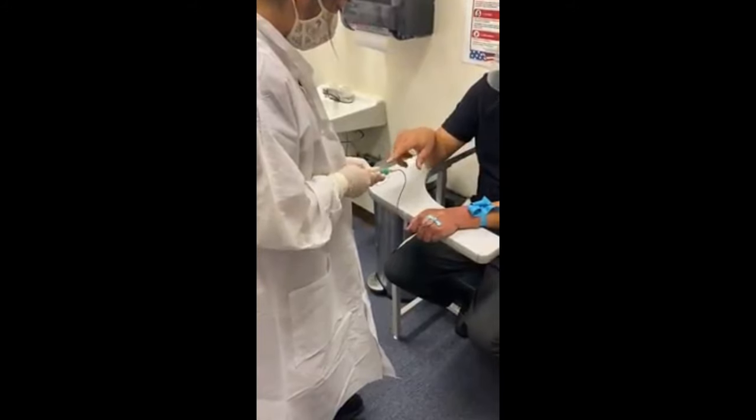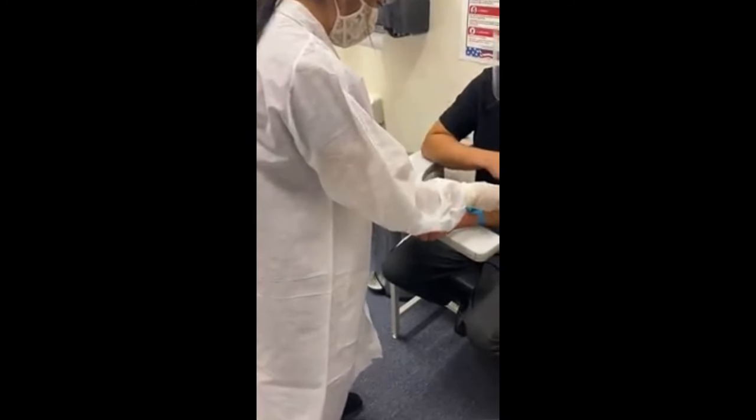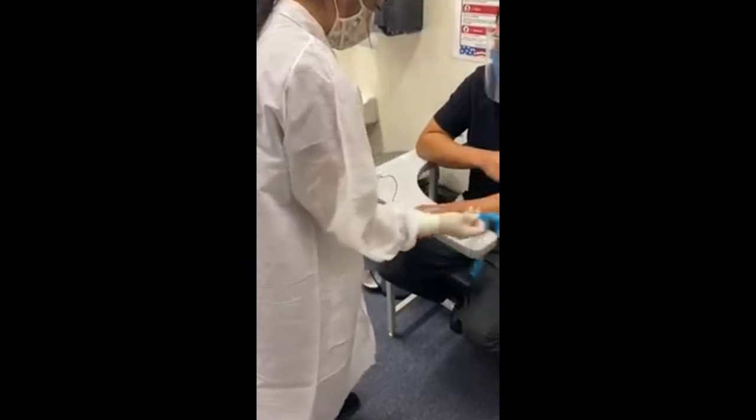So let's say this is your last one. Yeah, last one, okay. Pull out the tourniquet. Okay, good, perfect. Okay.